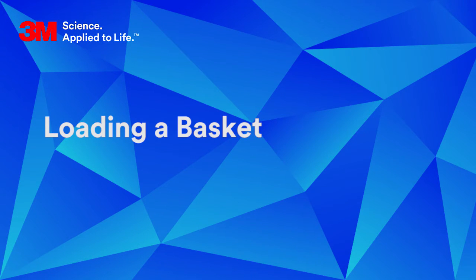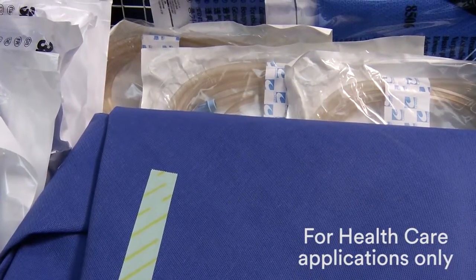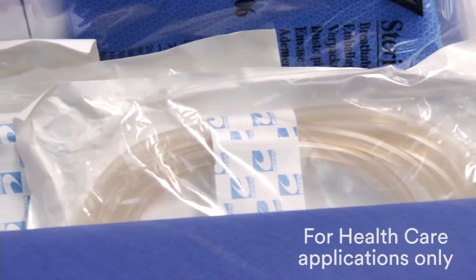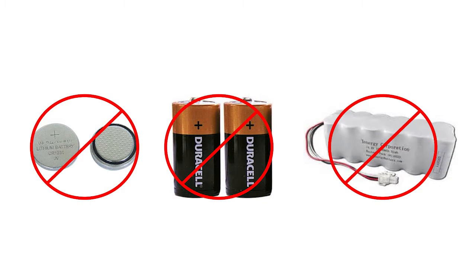For healthcare applications, clean, dry, and package all devices per their respective manufacturer's instructions for use prior to loading the packages into the sterilizer basket. Do not sterilize any devices with energy sources such as batteries that could create a spark inside the sterilization chamber during a sterilization cycle.